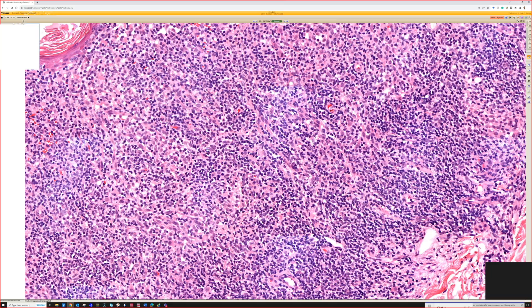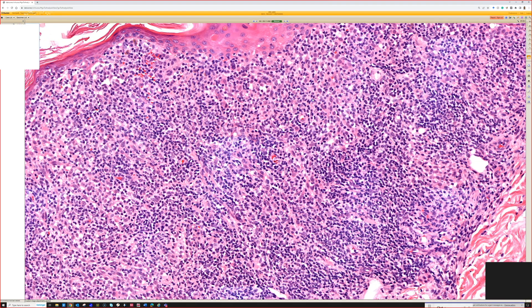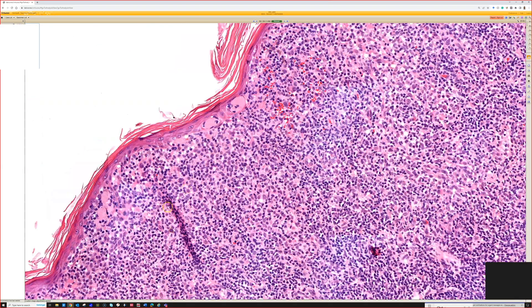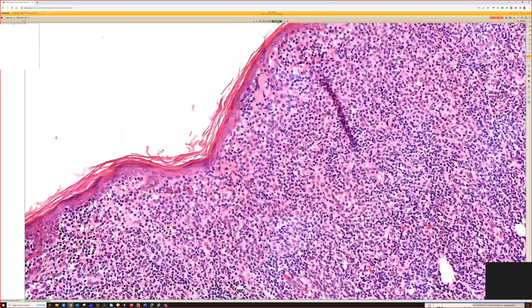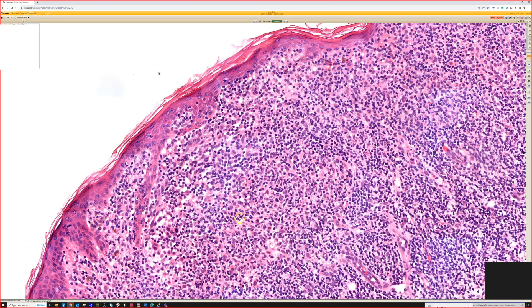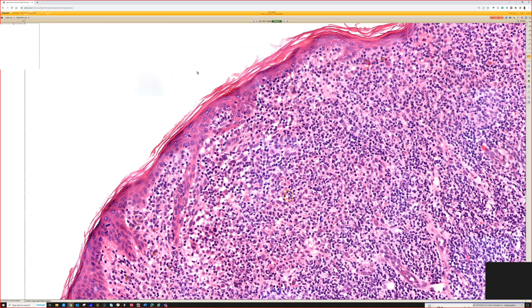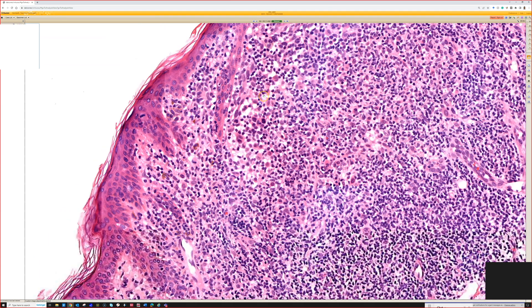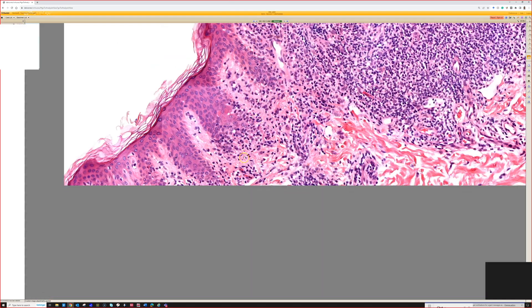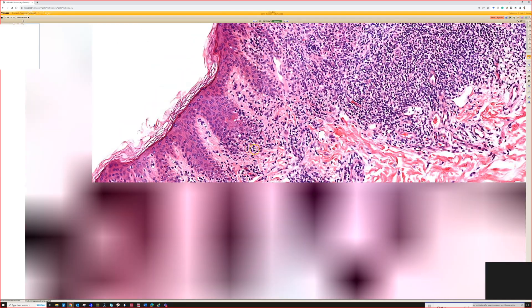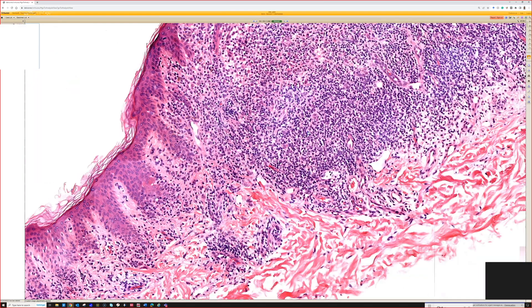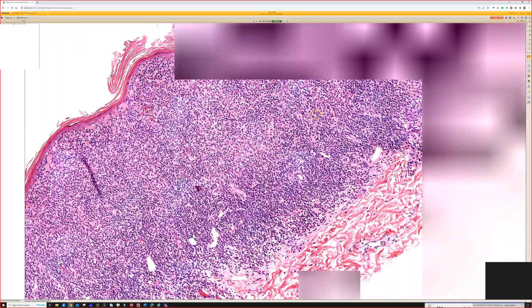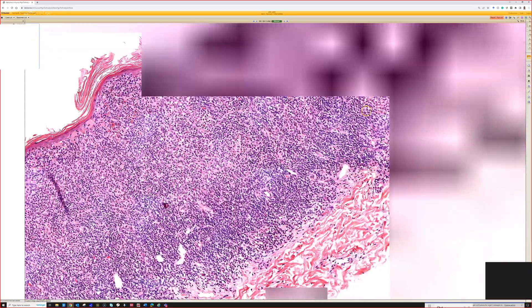It can be quite hard to tell at first unless you begin to see nests. In this case there is some nesting — some of these probably are histiocytes too, but there are melanocytes in there. If you go out to the periphery of the lesion you can sometimes see the melanocyte nesting a little better, perhaps on the other side.